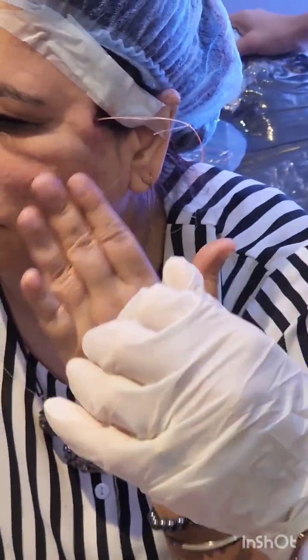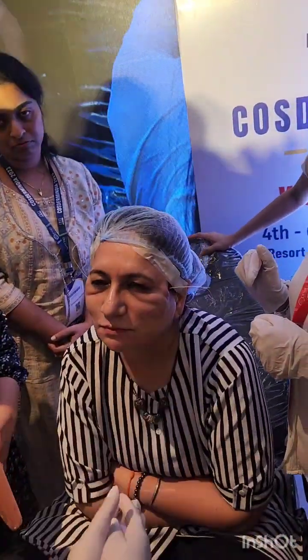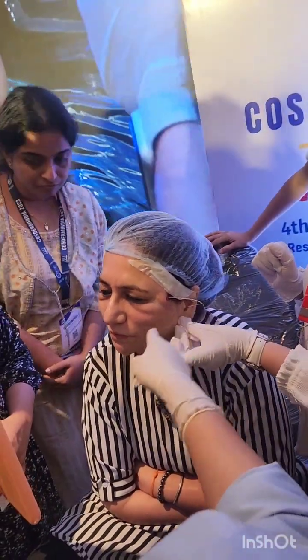How long? This dimpling, 7 to 10 days maximum. So it will stay like this only? No, everything will come down. I'll show you the picture. If you are comfortable, that's okay. If not, then I'll relax a little. Okay. So see, there are so many dimplings.